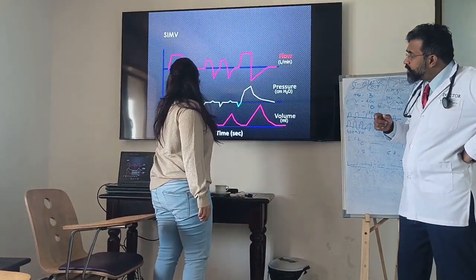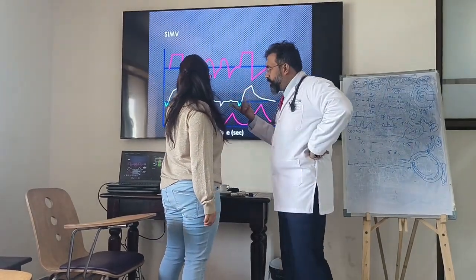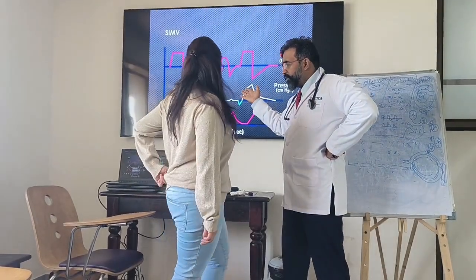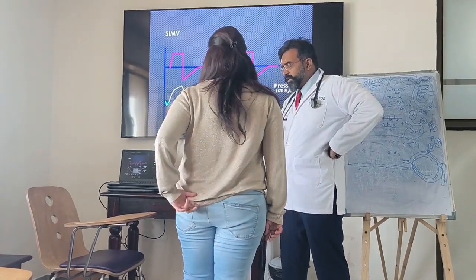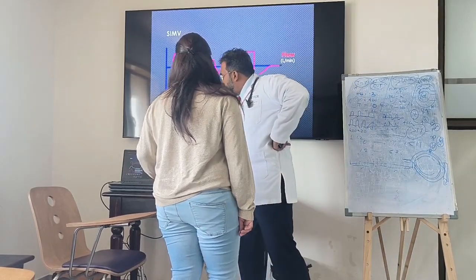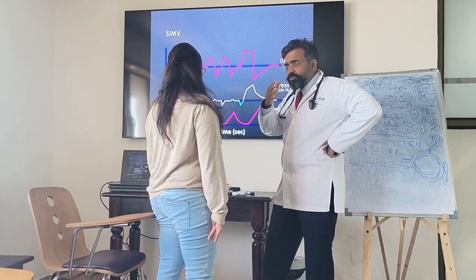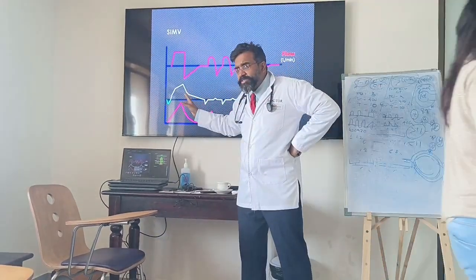Is this constant? No, it's variable. You have one pressure here, one pressure here, so the pressure is variable. So can this be pressure control? It cannot be. What you can say is that the volume is constant. Clear? So this is definitely not pressure control.